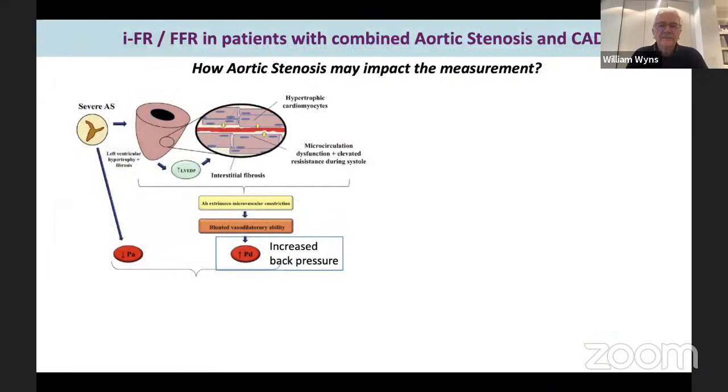Okay, that's clear. Now, one more topic, maybe the one that you've worked a lot on and that I still have many questions about. It is the assessment of CAD severity in patients who have coronary disease and aortic stenosis, obviously, in the context of TAVI. So tell us about the theory and what do we know as of today?